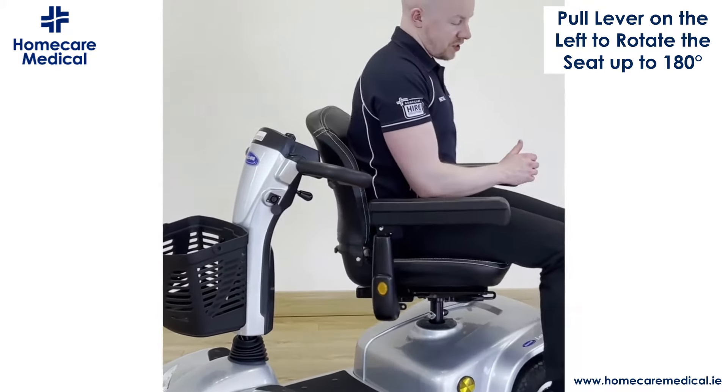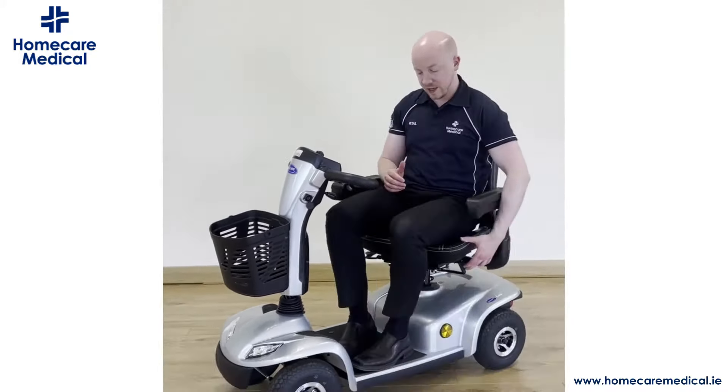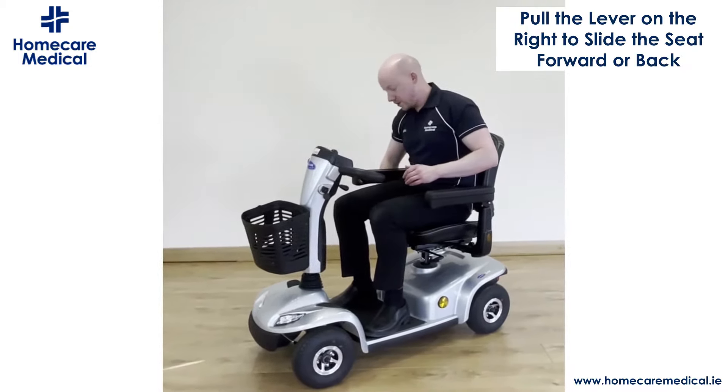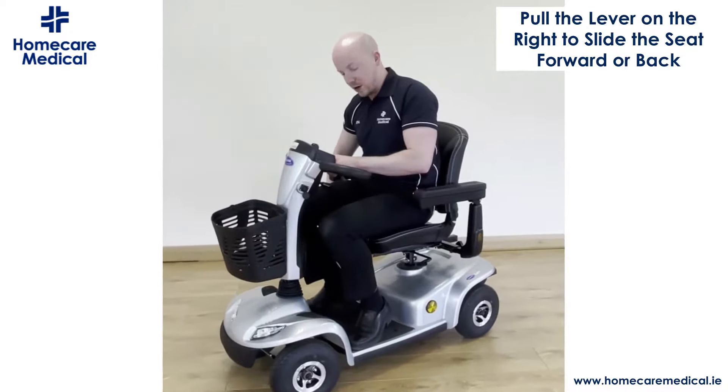To adjust the seat, it can rotate out to either side. You pull this lever and it can rotate up to 180 degrees. Release it and it'll lock itself back into place. There is also another lever on the right hand side that allows you to move the seat forward or back.